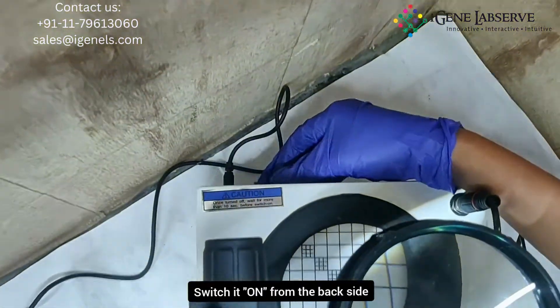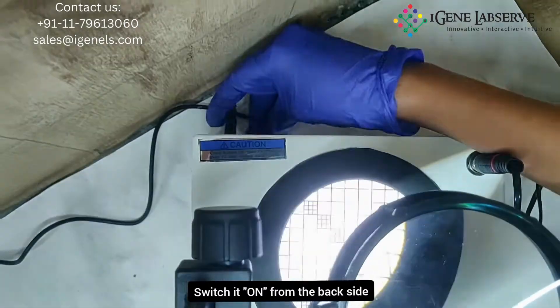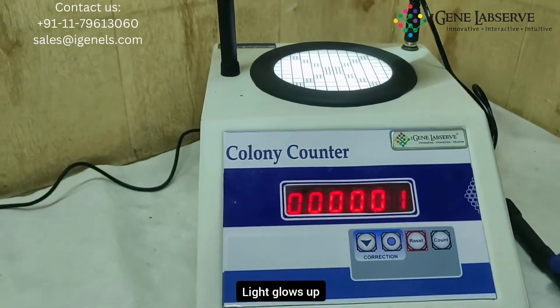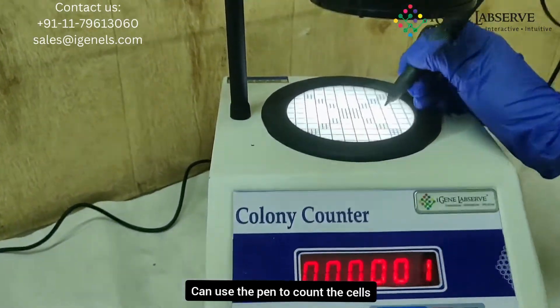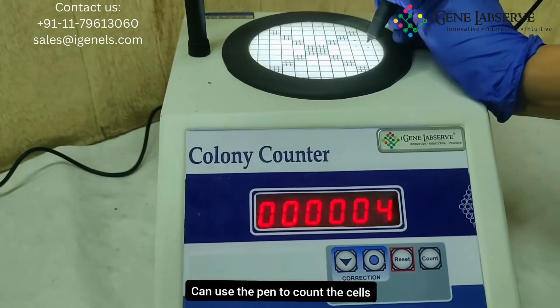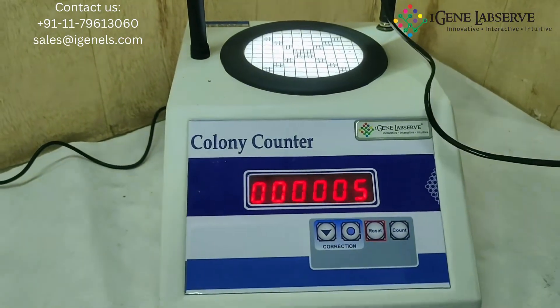To turn this on, you have to switch it on from the back side. This lights up and you can use the pen to count the cells here.